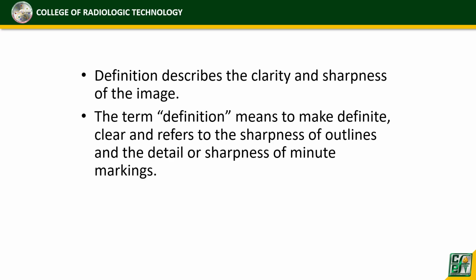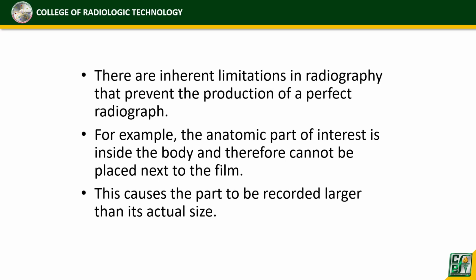Okay, so ano kaalaga ng definition? It is important that the definition of our image remains clear and sharp para pagdating sa interpretation, sa reading ng image is walang magiging problema ang radiologist. Hindi magkakaroon ng misdiagnosis. So there are inherent limitations in radiography that prevent the production of a perfect radiograph.